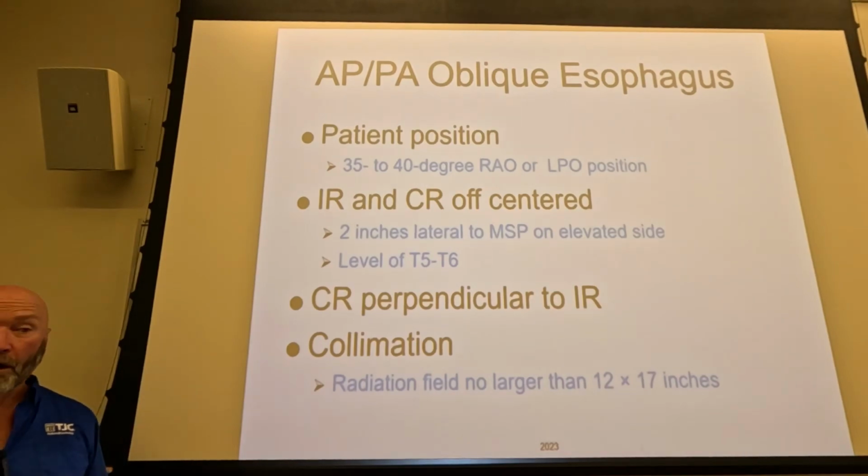Okay, so for all of your views, be it AP oblique, or your lateral, you're going to do basically that same thing. You're going to have a patient drink as fast and as much as they can.